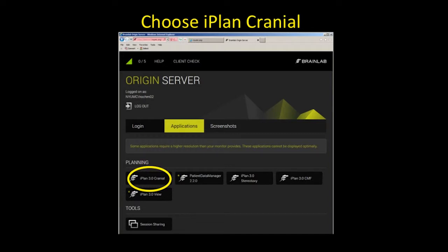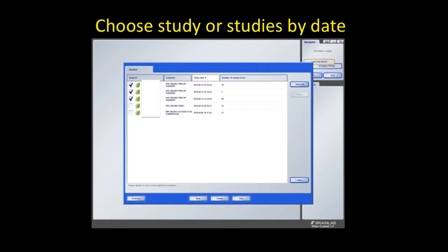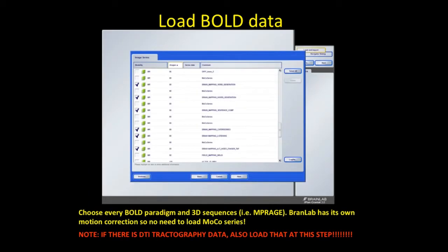First, you want to choose iPlan Cranial, and you want to choose your study or studies by date. Check marks show that you have selected the studies of interest. Then you hit next and load your language bold data. Choose every bold paradigm and the 3D structural sequences you want, like an MPRAGE or a FLAIR space.